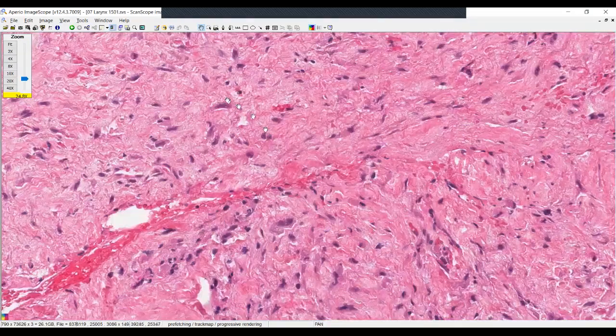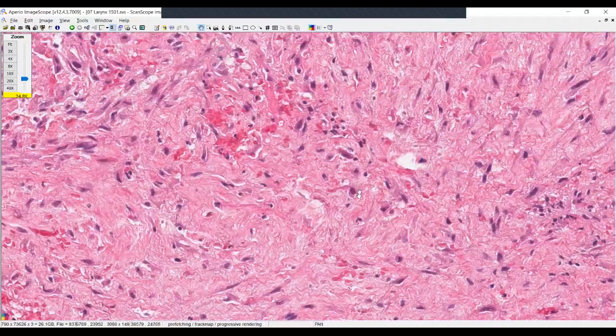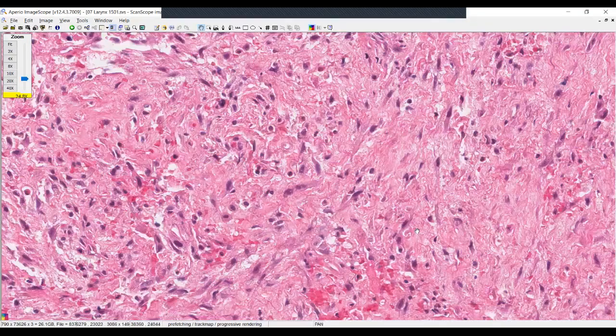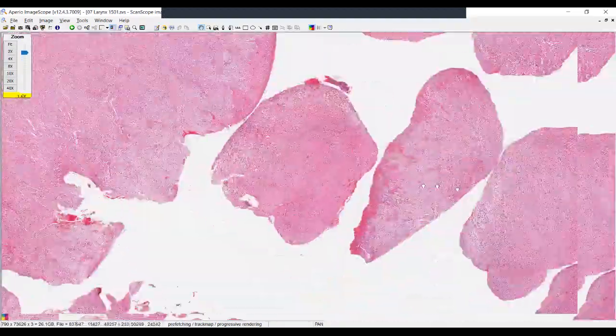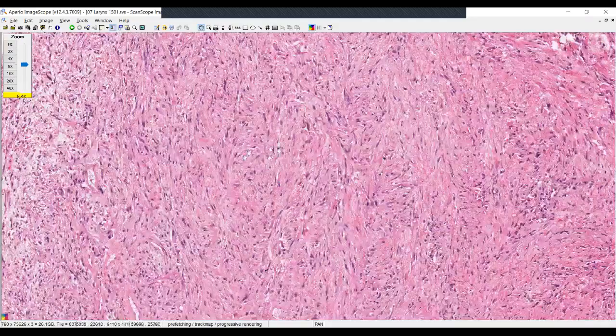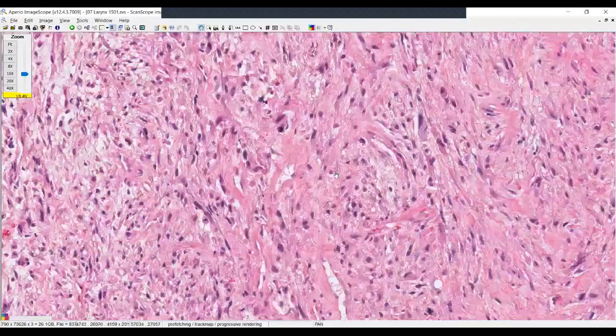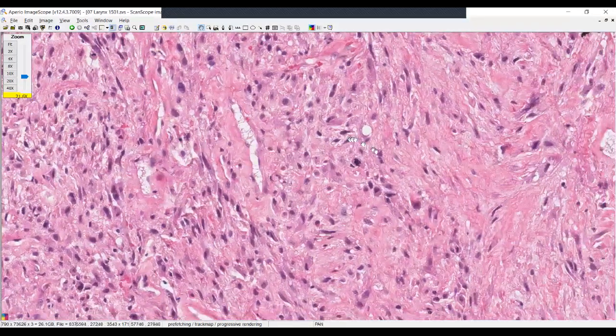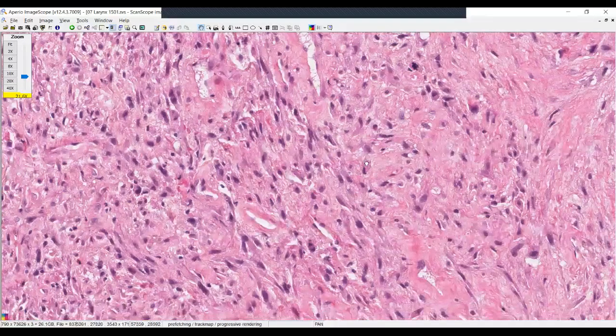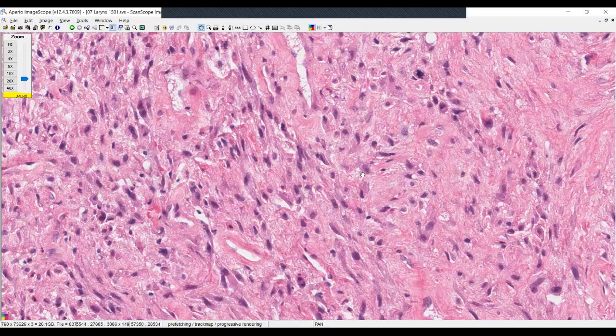But this is quite a common phenomenon for a spindle squamous cell carcinoma or spindle cell sarcomatoid squamous cell carcinoma, which is what this particular lesion represents. Now, as I look at other areas, you can tell that, again, the area of pleomorphism is quite easily identified. Many times it is a challenge to find mitotic figures. However, I think here you can see one where it is an atypical mitotic figure present in that field.